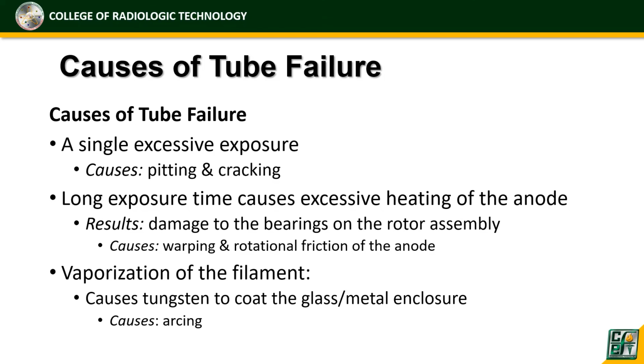Ang nagkakos nito ay yung arcing. Yung pagkakaroon ng spark doon sa loob, yung uncontrolled sparking or yung tinatawag natin arcing due to ionization of air or gases inside the vacuum tube. Supposed to be dapat walang air doon, di ba? Kasi vacuum tube ang ating X-ray tube.